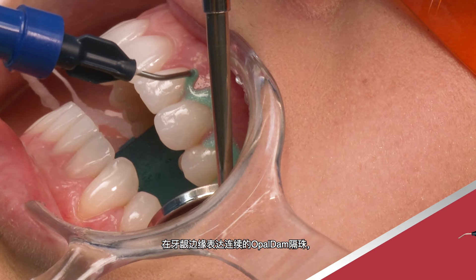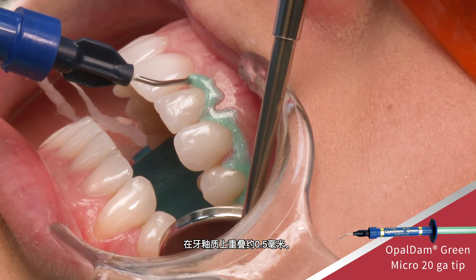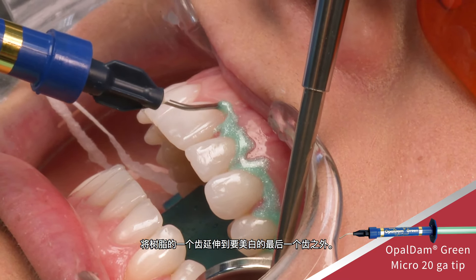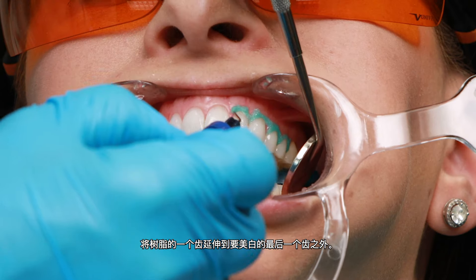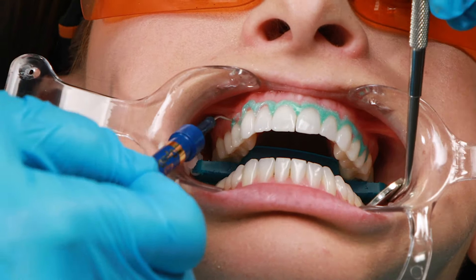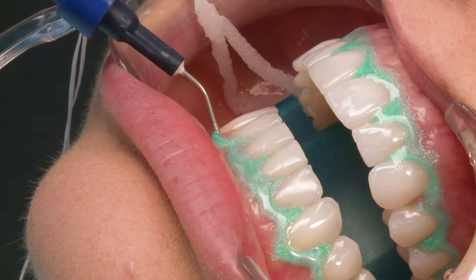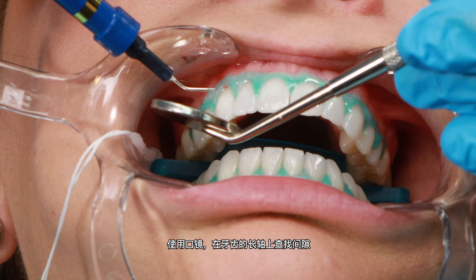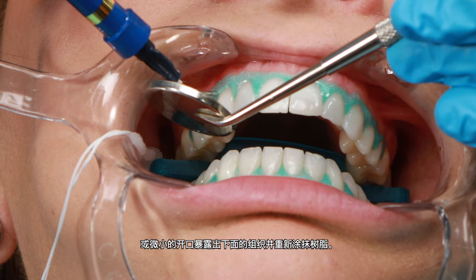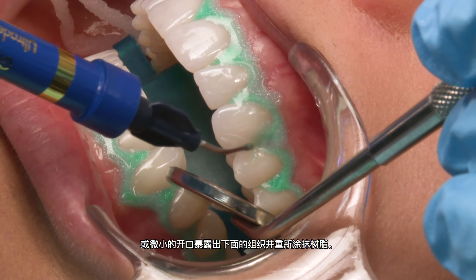Express a continuous bead of Opal Dam barrier along the gingival margin, overlapping approximately 0.5 mm onto the enamel. Extend the resin one tooth beyond the last tooth to be whitened. Using the mouth mirror, look up the long axis of the teeth for gaps or minute openings exposing underlying tissue and reapply resin.